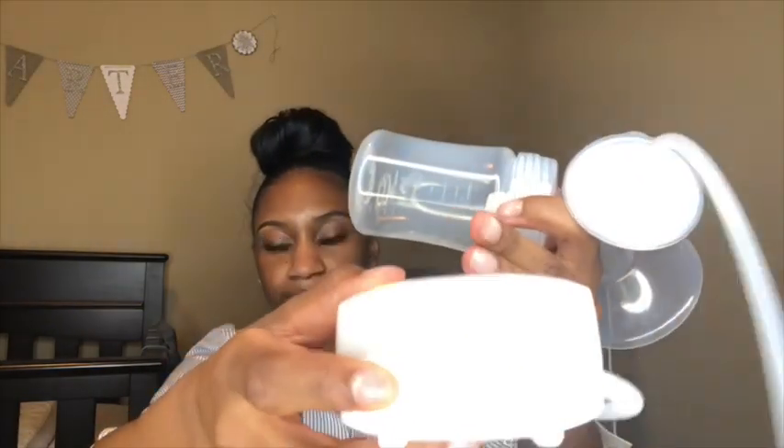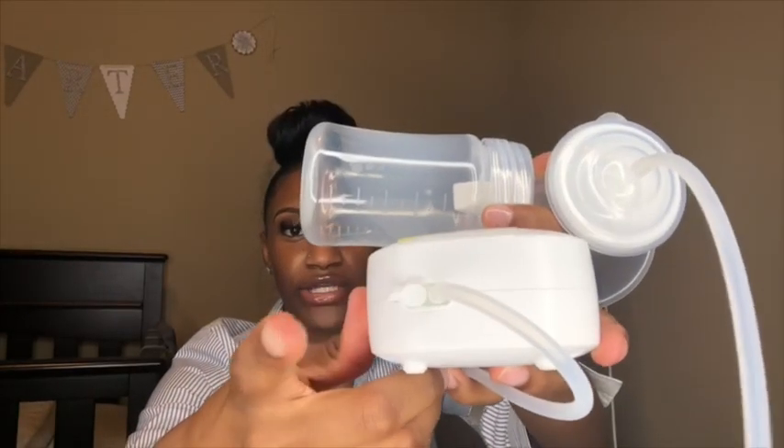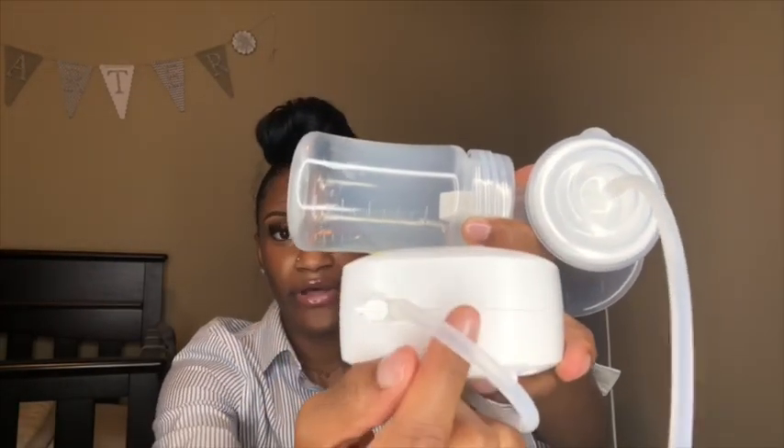You can pump one boob at a time because there is a stopper right here — you would plug this in and just put the other tube into here, then put this on your boob and turn it on. That's the setup. The other one is the same exact thing — easy peasy lemon squeezy.